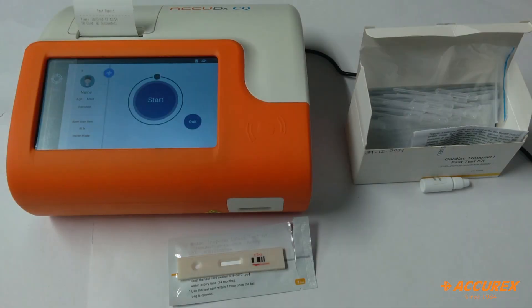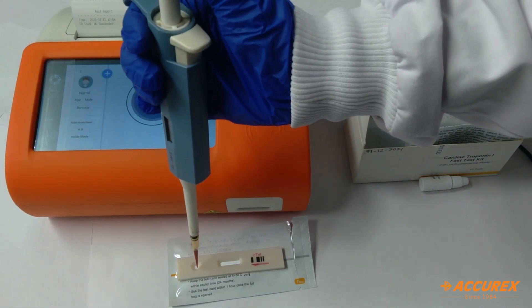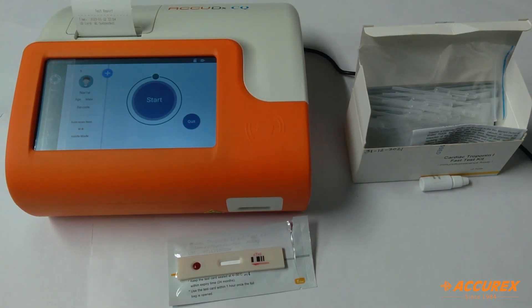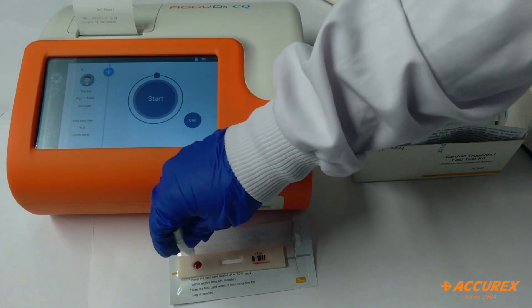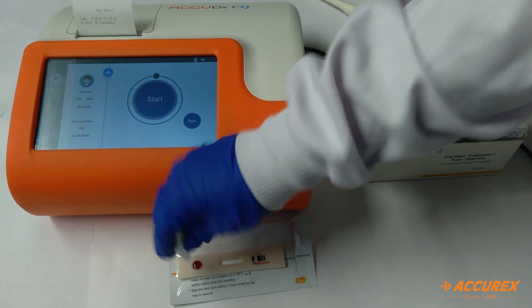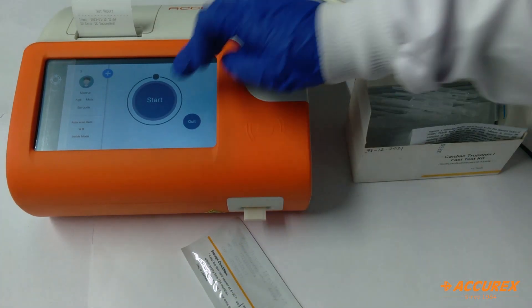I have taken 100 µL of sample — whole blood — and now I'll just pour it in this slot. Because I have taken whole blood, I'll put one drop of this buffer as well. Then we'll insert this test strip inside the analyzer and start the test.